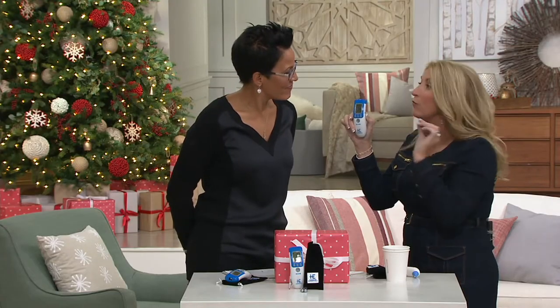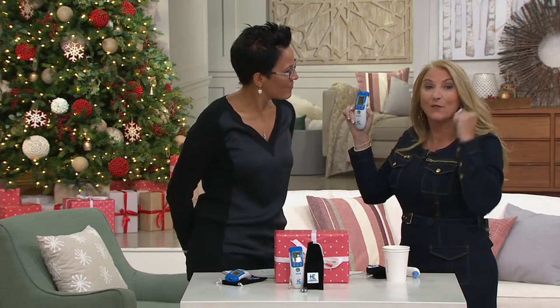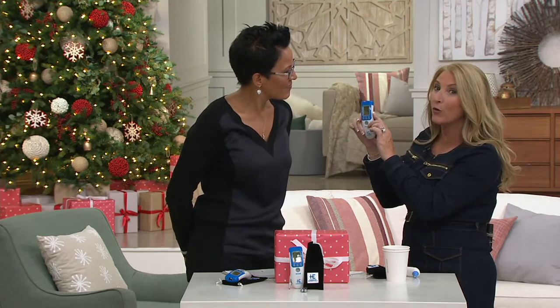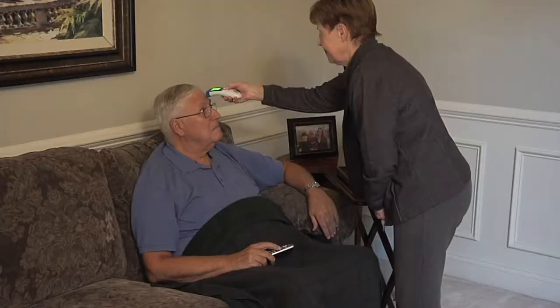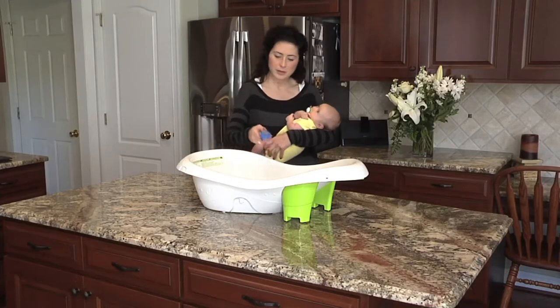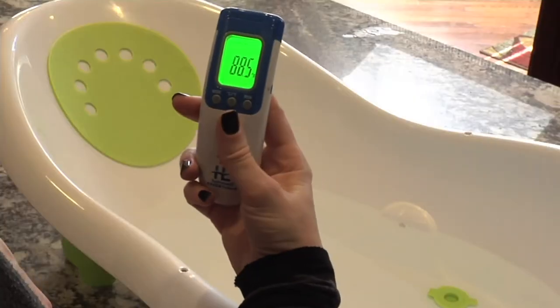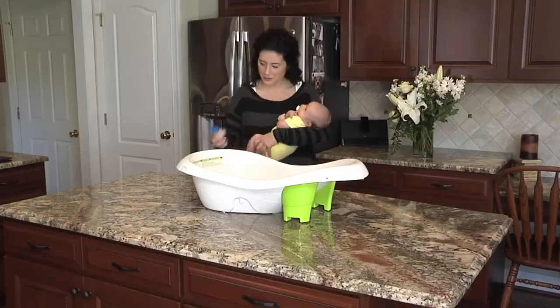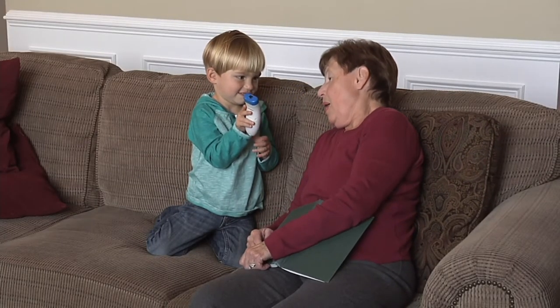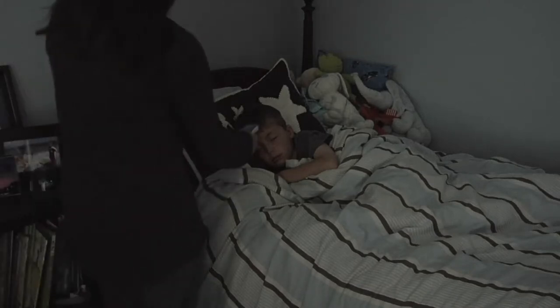It's a very big screen, it backlit green. So it'll backlight green if you're healthy, yellow if you're in the danger zone, red if your temperature is too high. It's going to save 32 readings. You can do Celsius or Fahrenheit, or have the sound on or off. And I couldn't live without this — it's a very thoughtful gift, and it's nice to know you're not cross-contaminating loved ones. While you're seeing on the video, it also takes surface and room temperature — that's a bonus. V34617. 97.5 — no temperature. We love that.